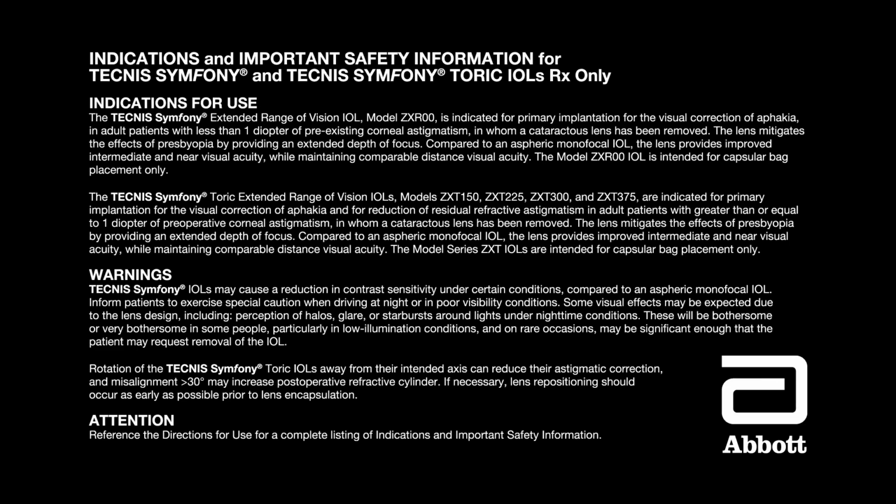Indications and important safety information for Tecnis Symfony and Tecnis Symfony Toric IOLs. RX only. Indications for use. The Tecnis Symfony IOL model ZXR00 is indicated for primary implantation for the visual correction of aphakia in adult patients with less than 1 diopter of pre-existing corneal astigmatism in whom a cataractous lens has been removed.